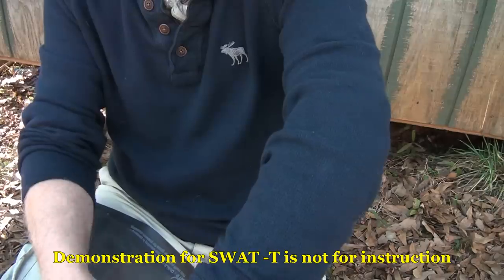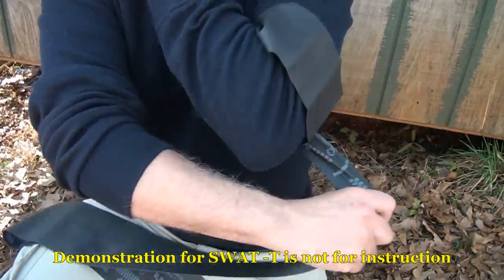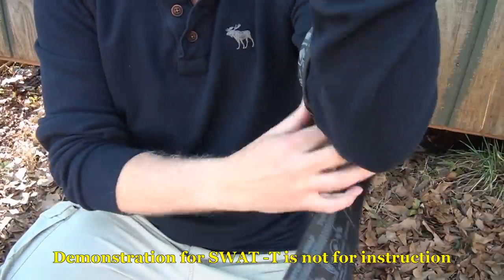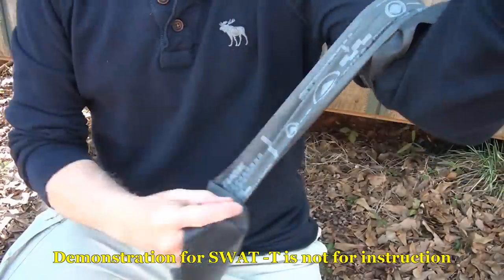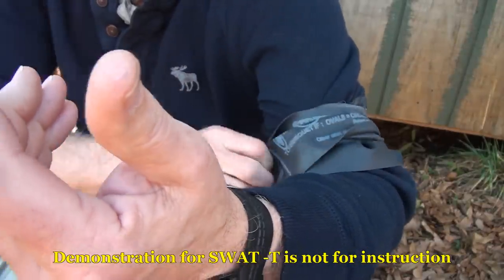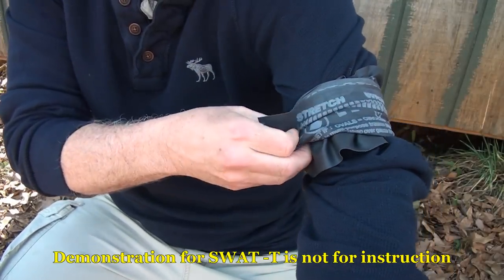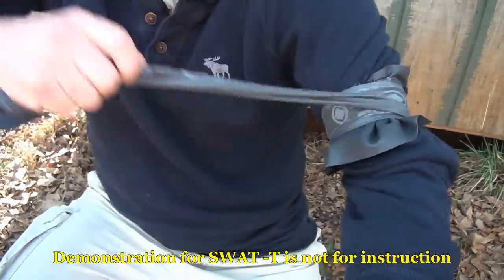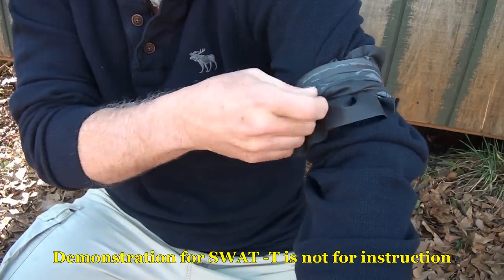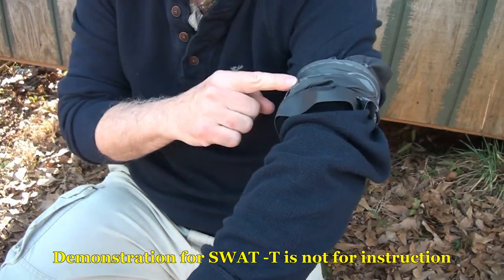Let's say that I have an injury right in this area. Now, of course, you want to get in between the heart and the wound. So you're going to go ahead and bring this around and then just start pulling pretty tightly. When I get it to a certain point, I'm going to want to tuck it. Because of this tight material, it's going to stay in place once you tuck it. And then it's there. Now, you don't want to feel your arterial pulse. When you have that stopped, that's when you know that it's tight enough.